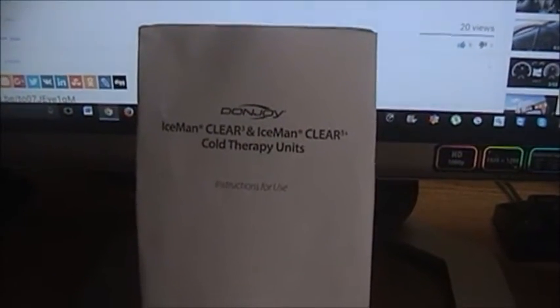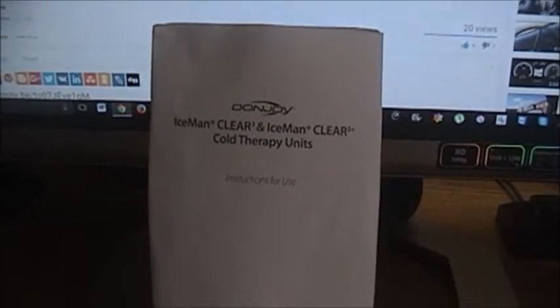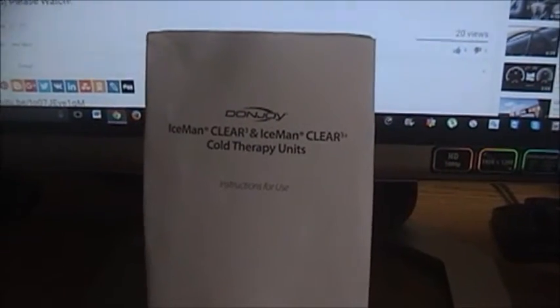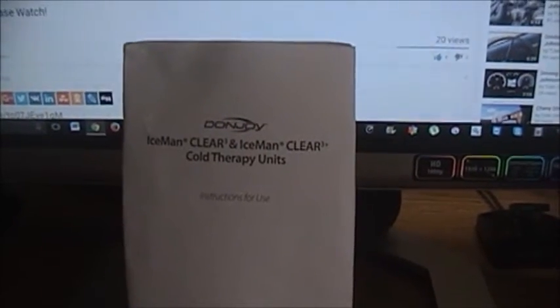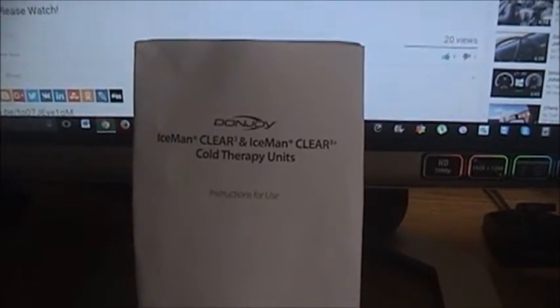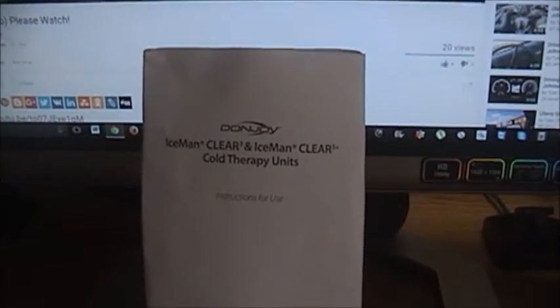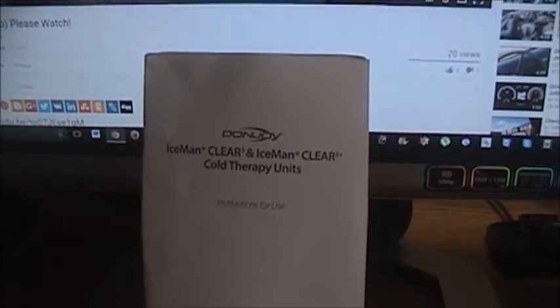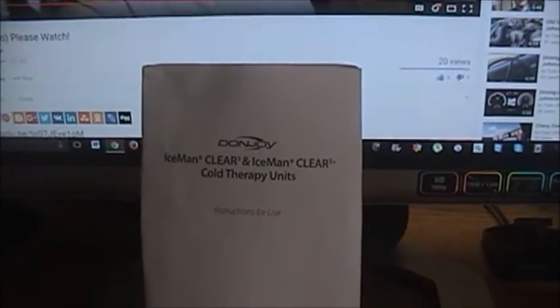I'm getting a lot of questions as to what needs to be done after you have knee replacement surgery. And I'm going to try to make this a series. So what I'm going to start with is what she uses to keep the swelling down. Because as most of you probably know, after any kind of surgery, the area where the incision is tends to swell up, and so do other areas that surround it.